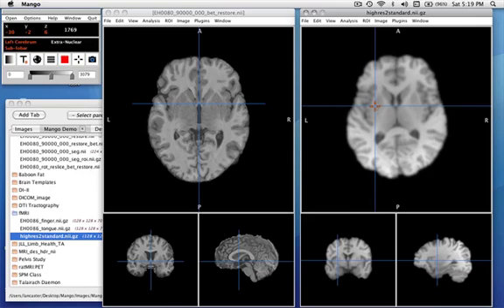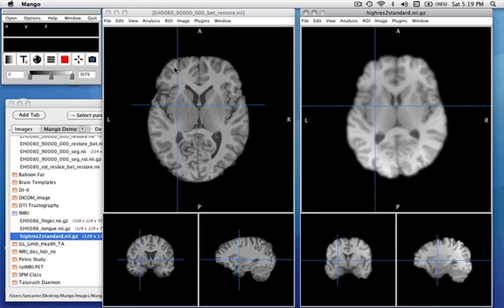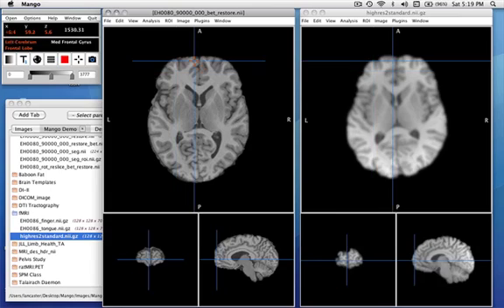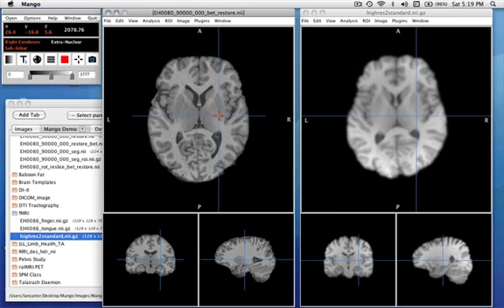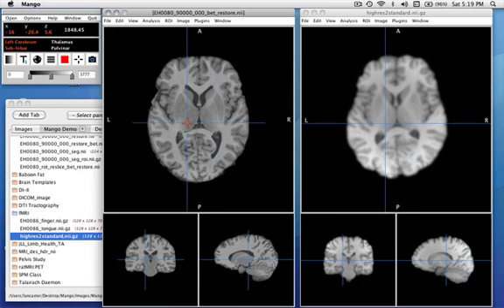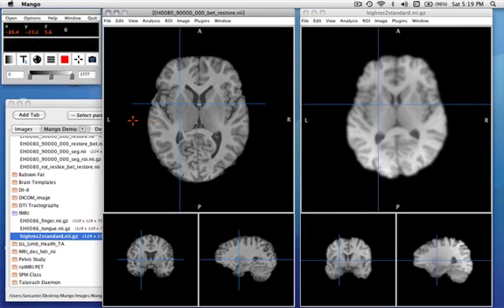So the nice thing about the world coordinate mode is that if I link navigation, I can now click in one image, and it moves the cursor to the same world coordinate in the other image. A very good feature for comparing locations in images of different spatial resolutions that have both been aligned to the same brain image space, in this case, Talairach.